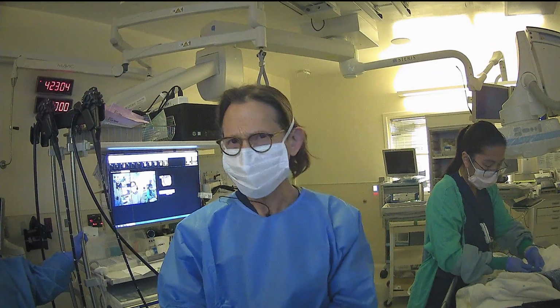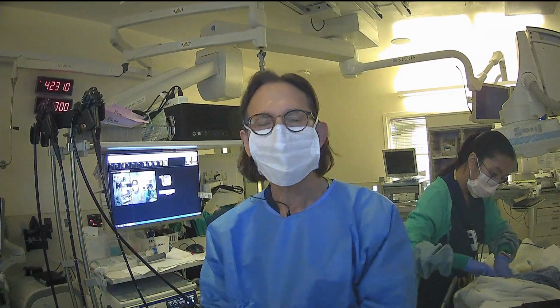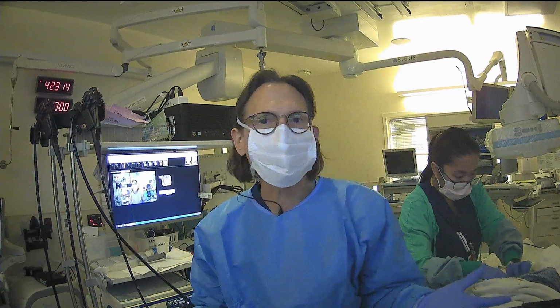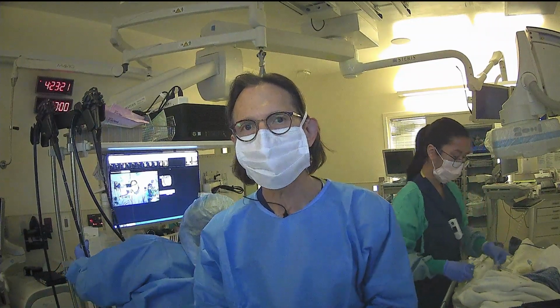Now, that has yet to be proven. There is a theoretical drawback to taking the patient off of PPI, and that would be that potentially, if there are some vessels along the wall, maybe the acidity could contribute to bleeding. There are pros and cons, and I think we really need randomized controlled trials to determine it one way or the other in terms of the benefit.